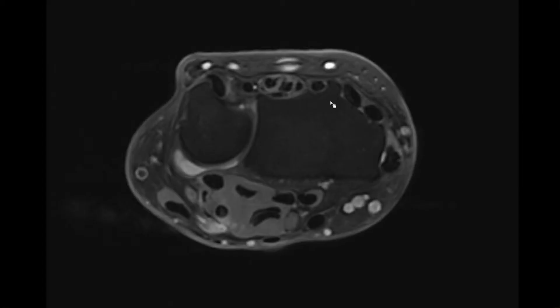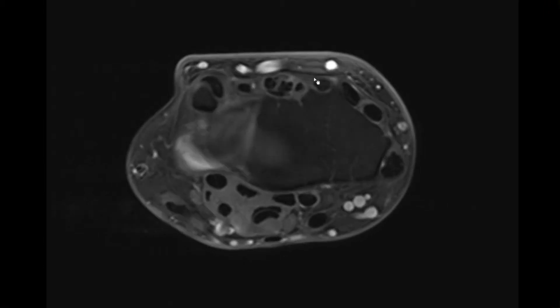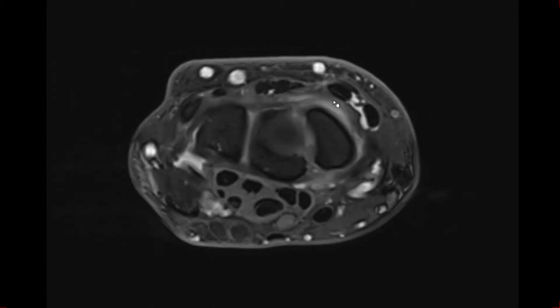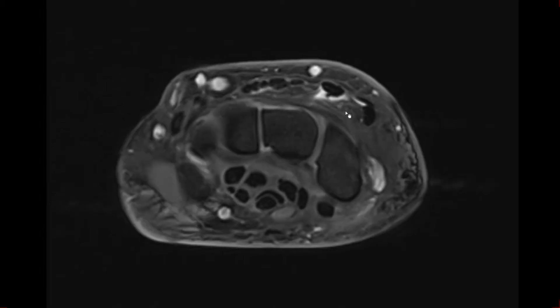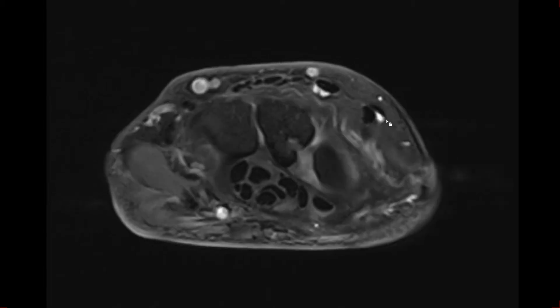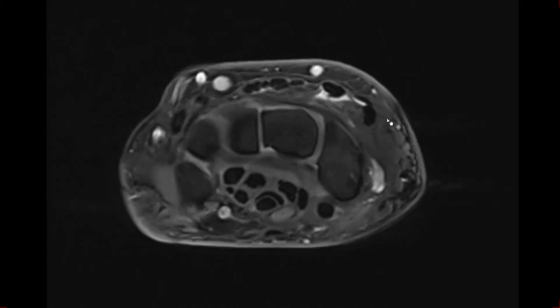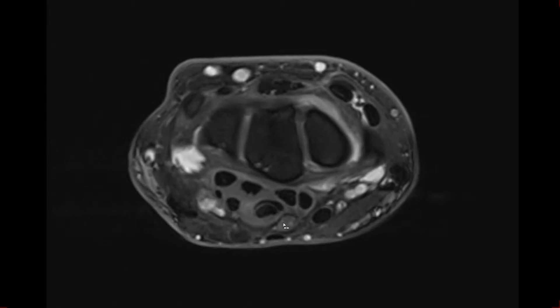In this next example, the second extensor compartment, third extensor compartment, and Lister's tubercle are identified, where the extensor pollicis longus slings around and crosses the second extensor compartment. There is too much fluid in the tendon sheaths of all the tendons here — ECRB, ECRL, and EPL — consistent with a distal intersection syndrome.